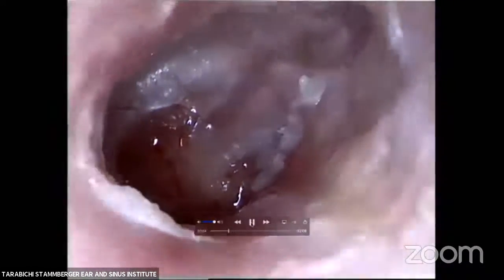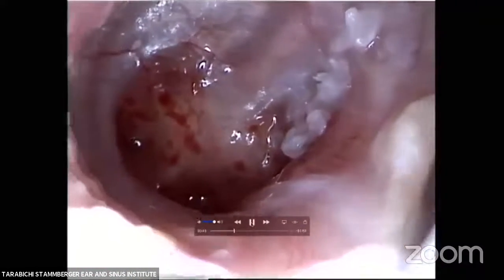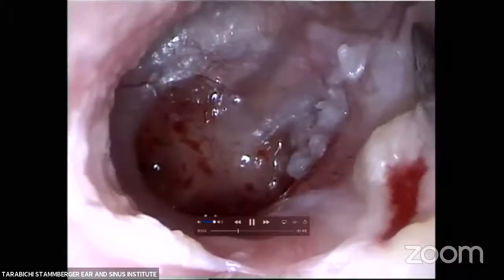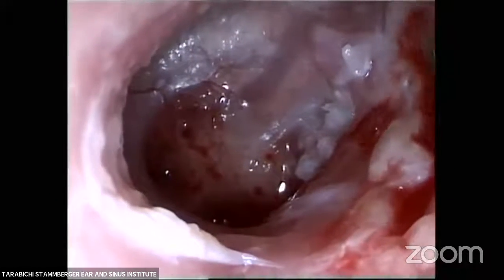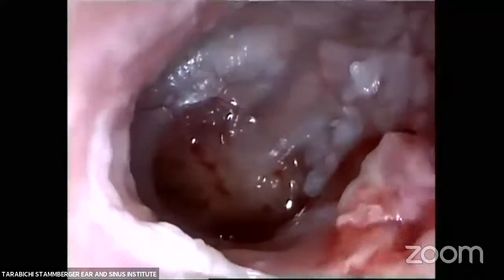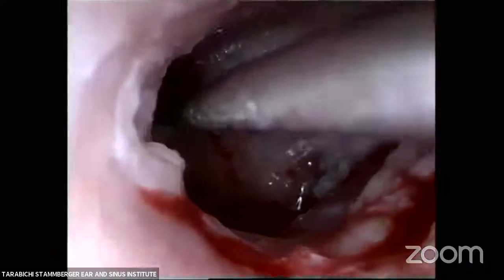So doing my tympanomeatal flap, and in this instance, again, this is a recent video, like 6 months ago. You could see that I'm doing a very short tympanomeatal flap because I really want to tuck it in anteriorly while I'm working posteriorly. And you can see how wide the tympanomeatal flap is. See the other limb, it extends really anteriorly, almost parallel to the annulus. See how far I'm going in?